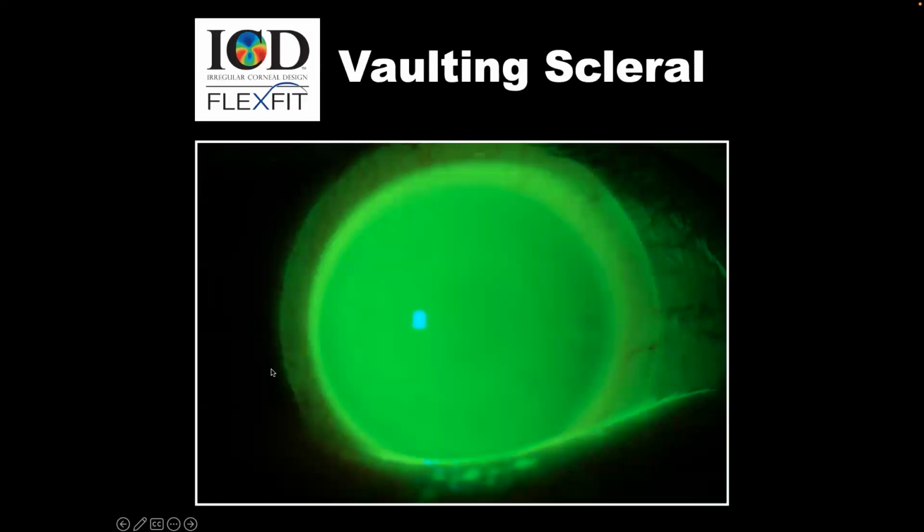As we know, what we try to do with the scleral lens is vault over the cornea, peripheral cornea, and limbus, and just create enough clearance over that sensitive tissue, that is the cornea. So we need to emphasize having enough vault to ensure that we do not touch or bear on the corneal or limbal surface. And this is very important to avoid any type of issues later on with the lens touching the cornea, right?